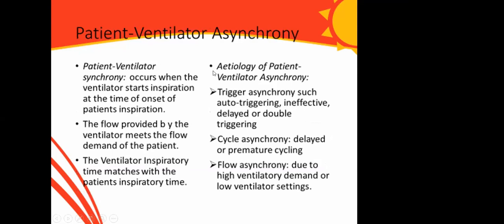Another thing you will definitely come across is a very popular terminology known as patient ventilator asynchrony. In colloquial parlance, we say the patient is fighting the ventilator, or the patient is balking on the ventilator. The actual term is patient ventilator asynchrony, PVA. What does this mean?